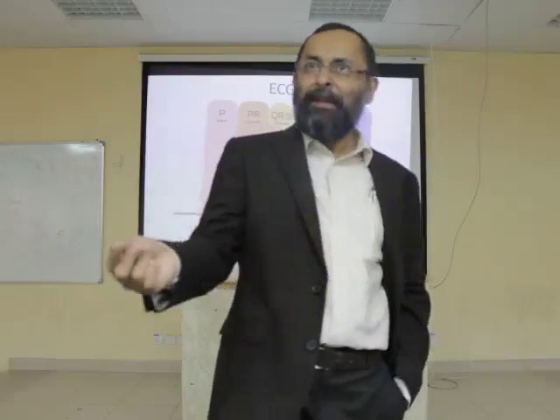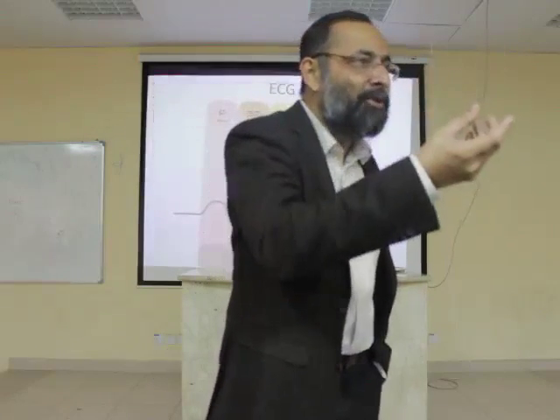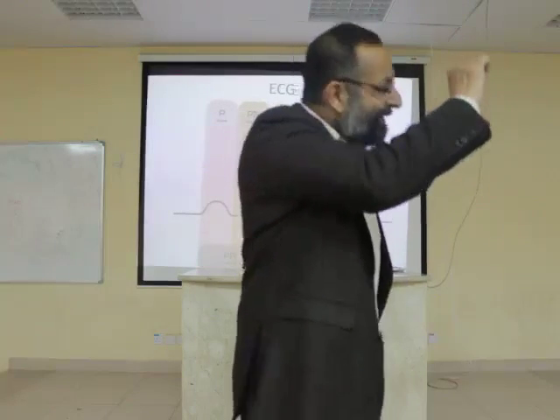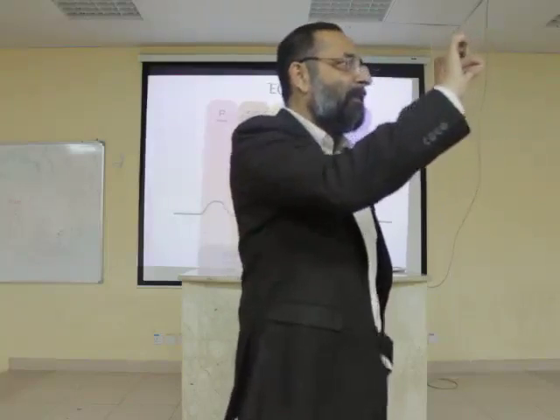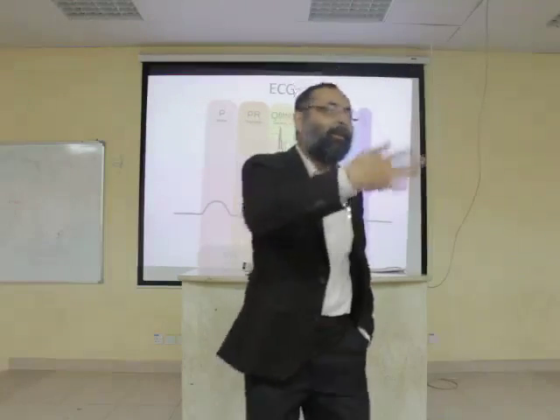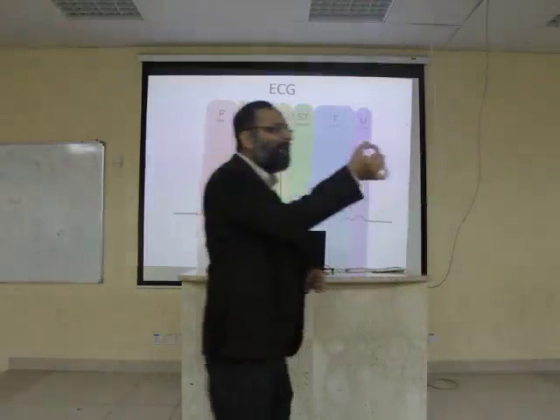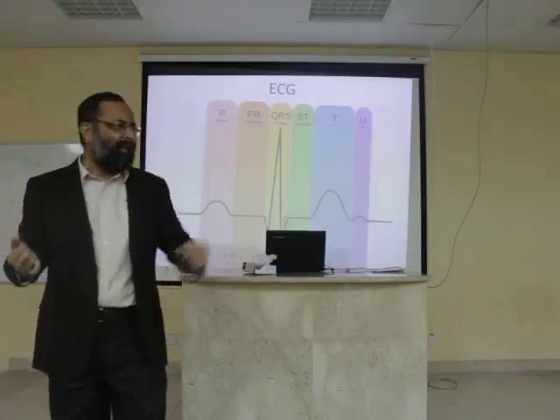Do you remember the papillary muscles inside the heart? When they have a slow repolarization, sometimes they form a little wave, but it's not necessary that you have this wave all the time. That's why we don't describe it. Sometimes U waves are very big and very prominent. Now, that's not a good thing. That is some pathology.